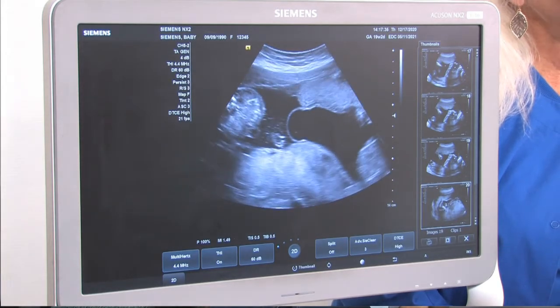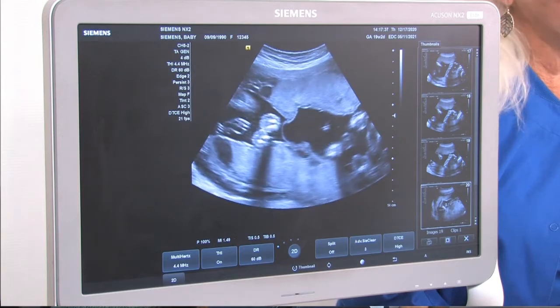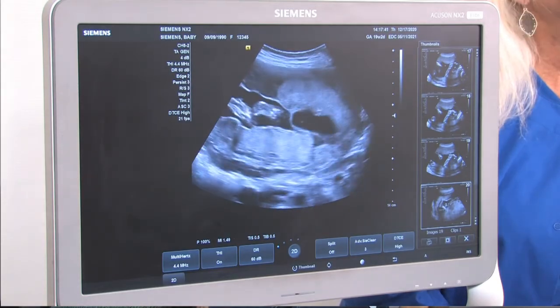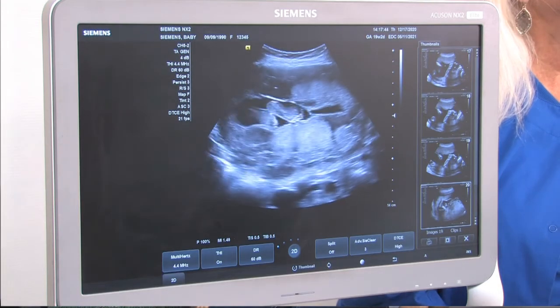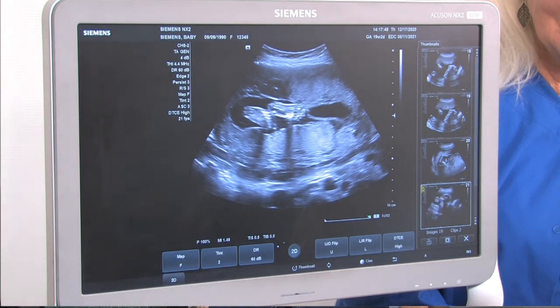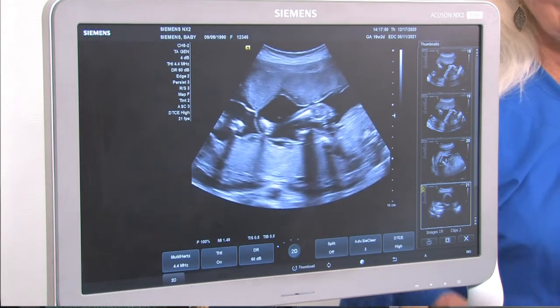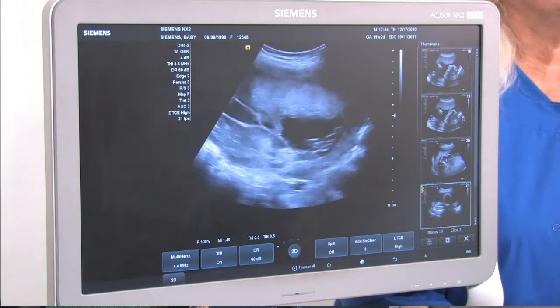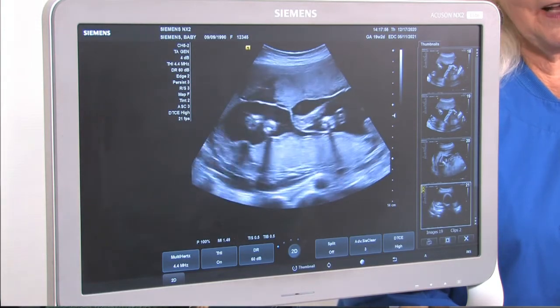So she's demonstrating with this clip that there are twins, doing a moving image. Oh, I wonder if I can get all 4 feet. There's the 2 feet for that baby. Look at that. So she's captured twins. How many seconds do you have it set for? You can set it for whatever you want. Totally customizable.